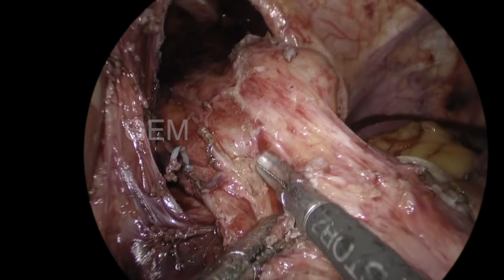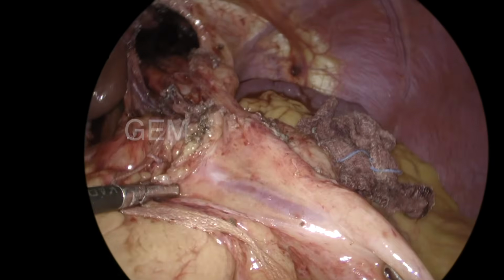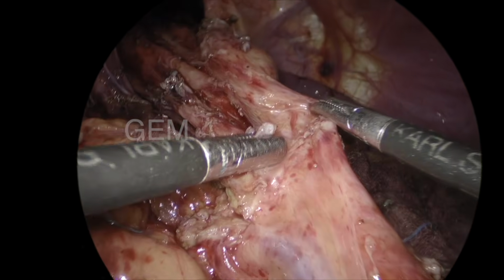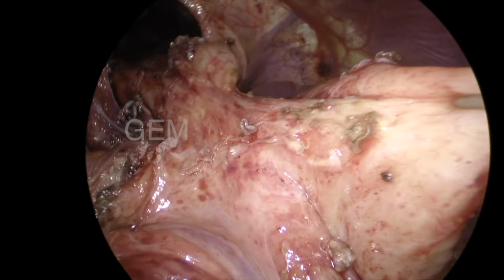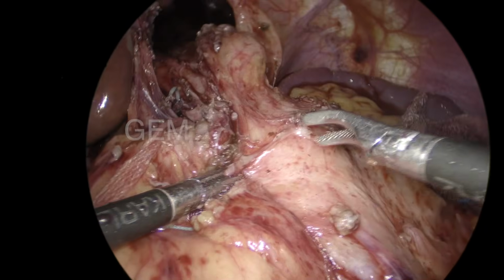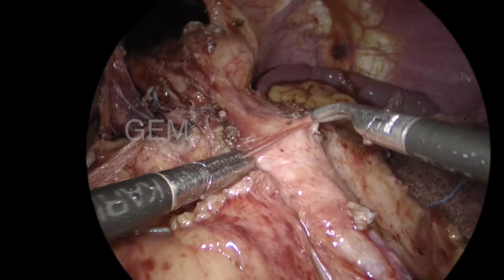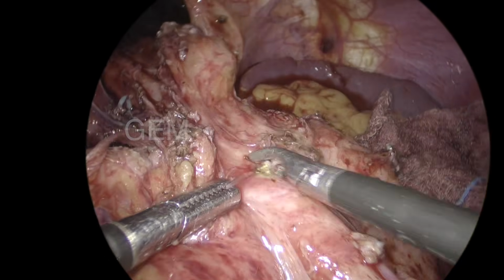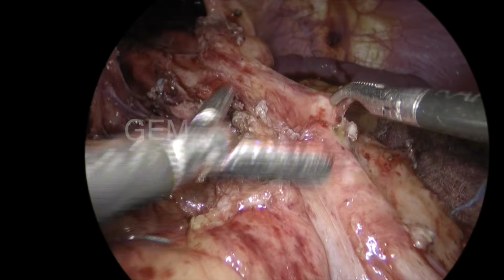That is the mucosa of the esophagus, and that is the OG junction area muscle. That is the undivided muscle at the OG junction. So, that is the OG junction, and I have to come down around 3 centimeter. Normally it is 2 centimeter; in Redo Hellers, it is called extended myotomy on the gastric side. So, a 3 centimeter myotomy is to be done on the gastric side. I am marking up to what level I have to do the gastric myotomy.